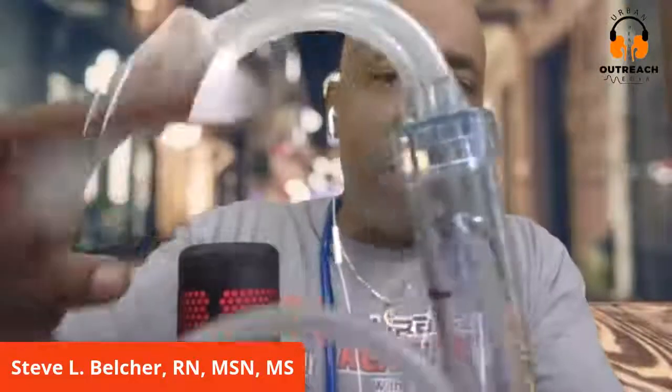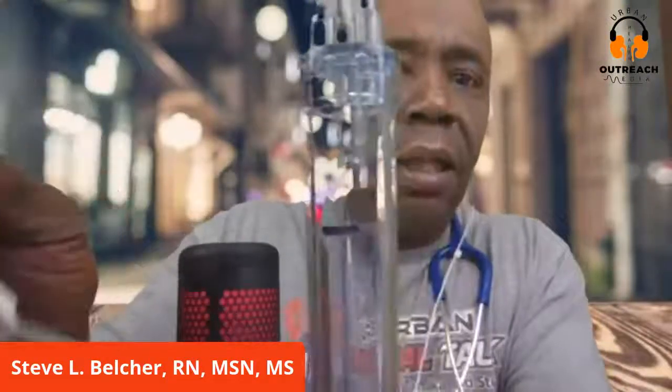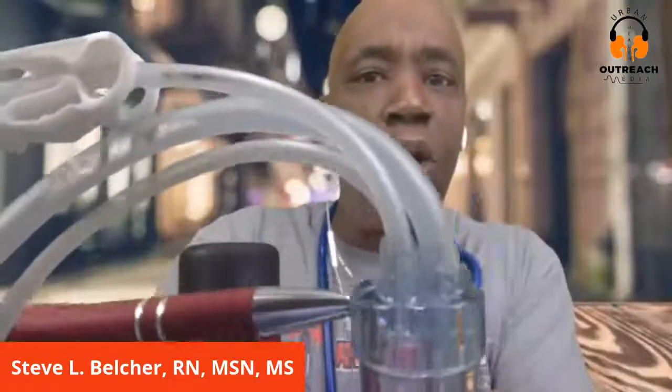And then let me tell you, you see this line, this black line? That's where your blood should be filled up at, right there. Because if you see this tube, you see the blood pours down. If the blood level is all the way up to the top, it still flows down, but blood starts to pool at the top, putting you at risk of forming a big thrombi or clot at the top of this. And then that's when pressure starts going up, the TMP, the venous pressure, and then they got to end up changing the machine.